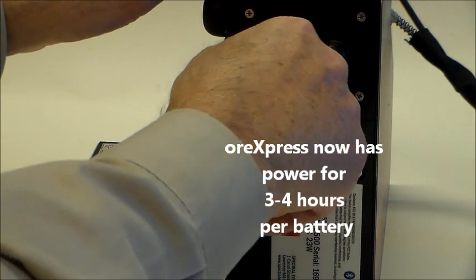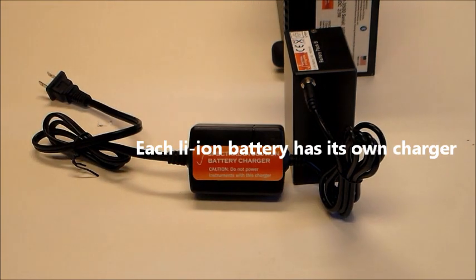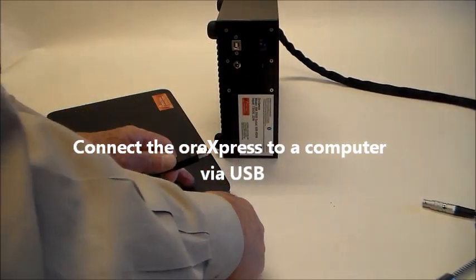Each battery provides three to four hours of power in the field. Each battery comes with its own charger. Connecting a computer with the USB cable is simple and straightforward.